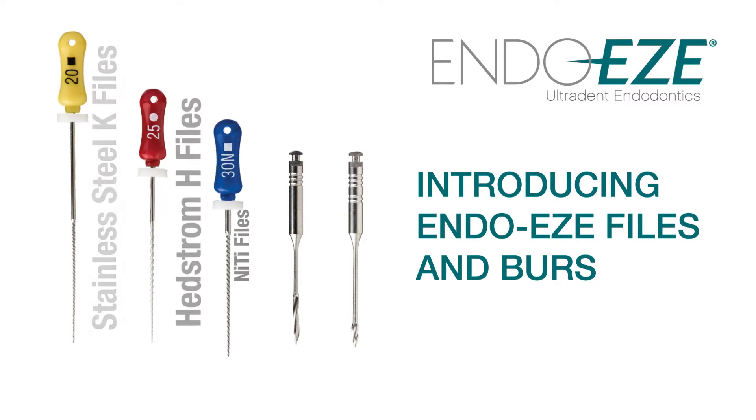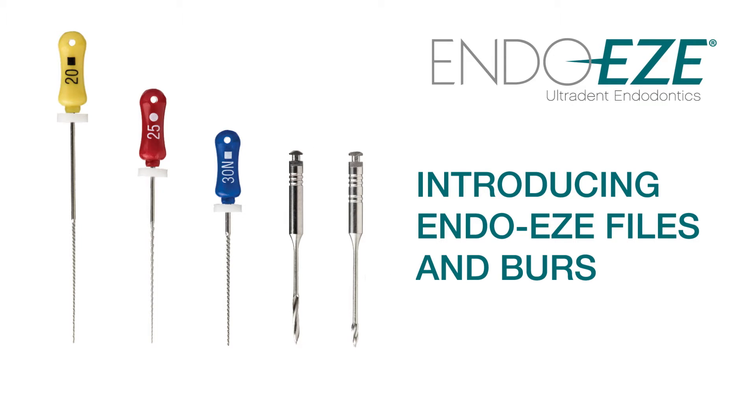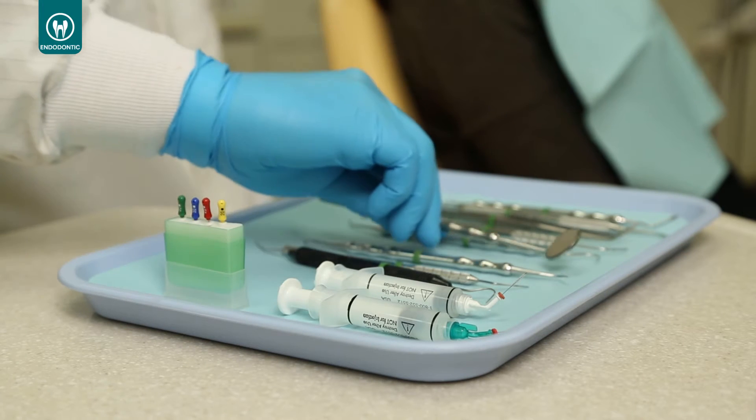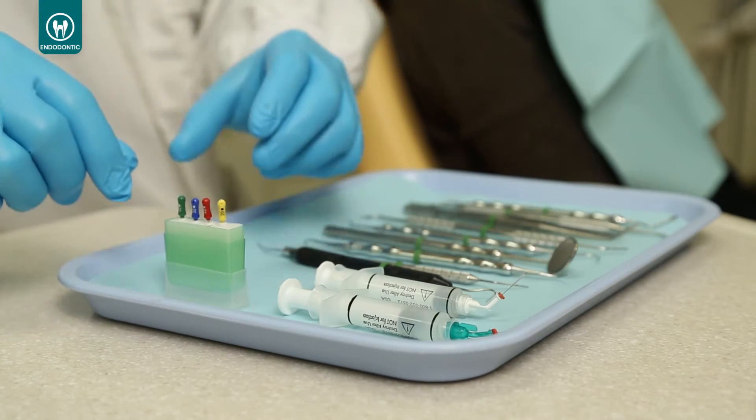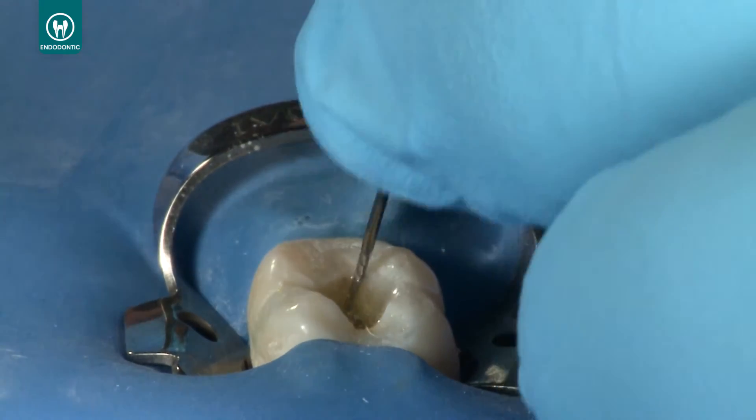Ultradent is pleased to introduce you to the EndoEase Endodontic Hand Files and Burrs. Hand files and burrs are essential tools needed every day in endodontic practice for cleaning and shaping the canal during instrumentation.